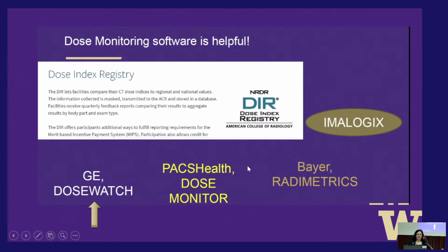Sam pointed out, and I also wanted to point out, that there are many, many different dose monitoring software packages, and they really are helpful in spite of all the issues with them. No monitoring software is perfect, but they're really great at doing dose monitoring in an automated fashion. At our site, we use Dosewatch. We are not like Sam's hospital. We don't have that much money. We have one dose monitoring system.